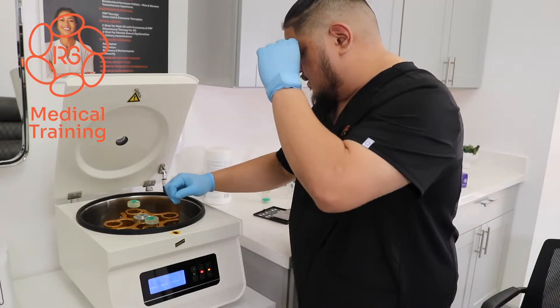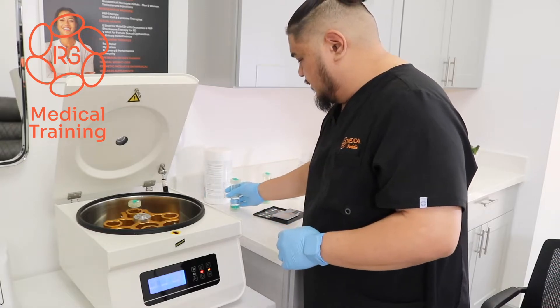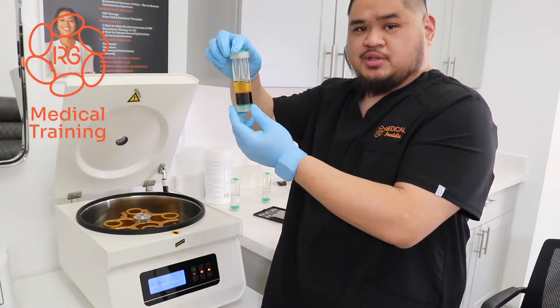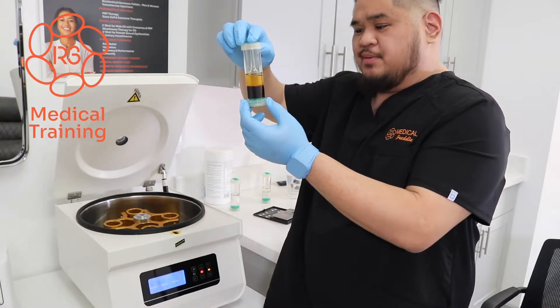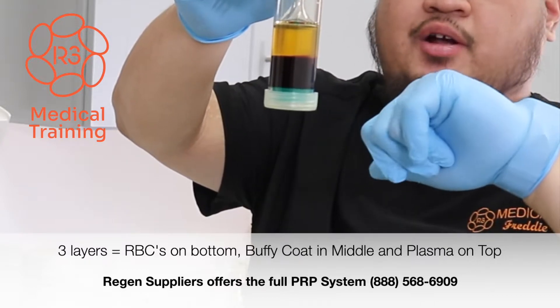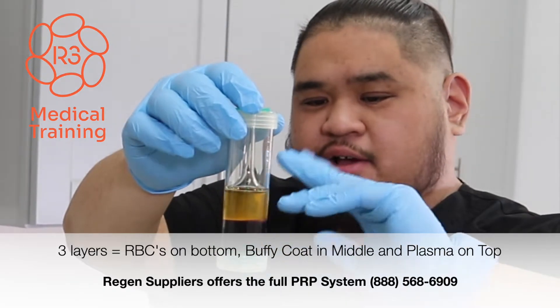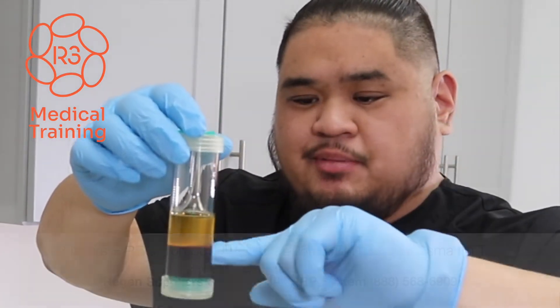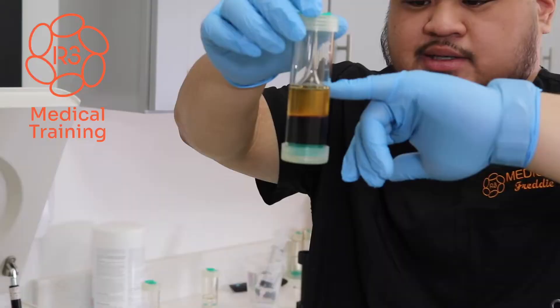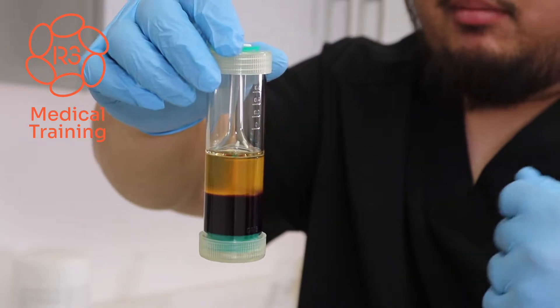Once the centrifuge opens and the spin cycle stops, you can go ahead and pull out the counterbalance, put it aside, and take a look at the tube with the blood specimen we just spun down to check for separation. As you can see, there are three distinct layers. You have the red blood cells at the bottom. In the middle you can see the cloudy, milky mass, which is what we call our buffy layer, and everything else on top from the red blood cells to the top layer would be your plasma layer.